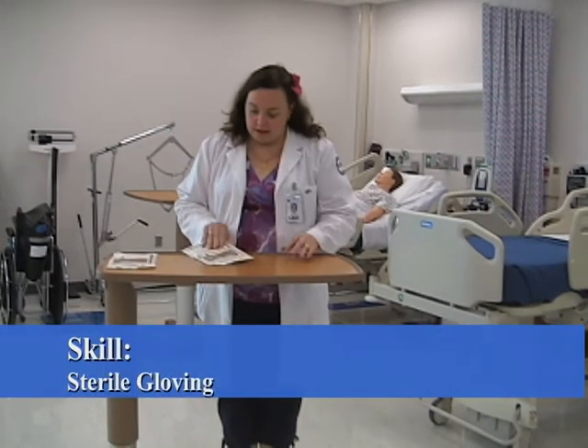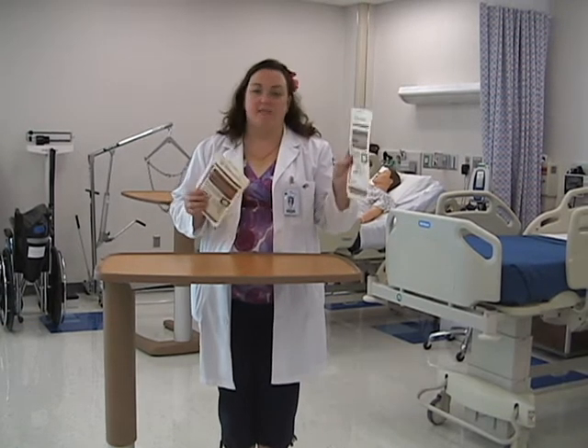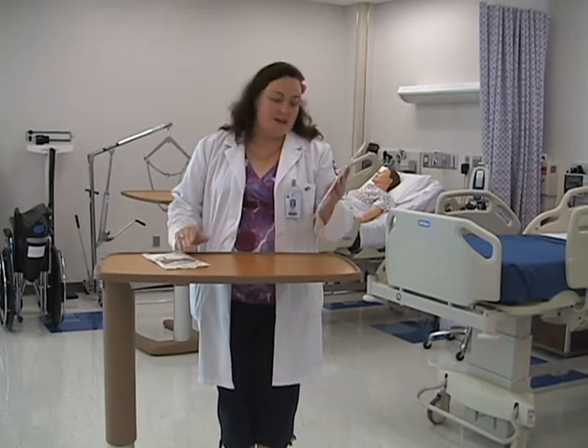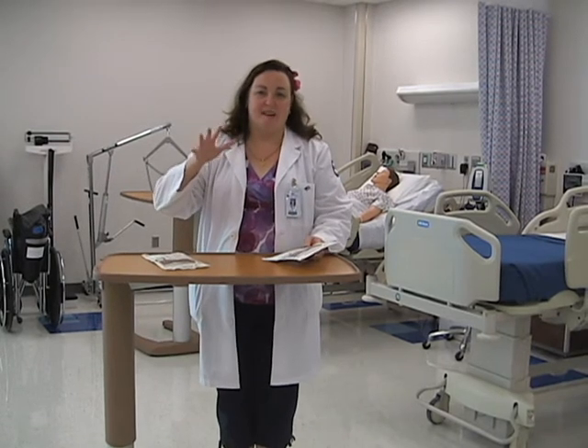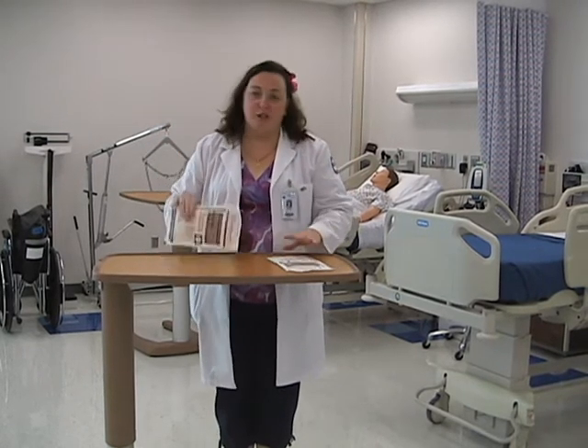When you go to get your gloves for sterile gloving, please make sure of two things: size and type. In this case, these are size 7 and size 8. Size 7 is about a small to medium size; 6 and a half is about a size small for your hands. As you can see, I do not have small hands, so I'm going to use the 8.